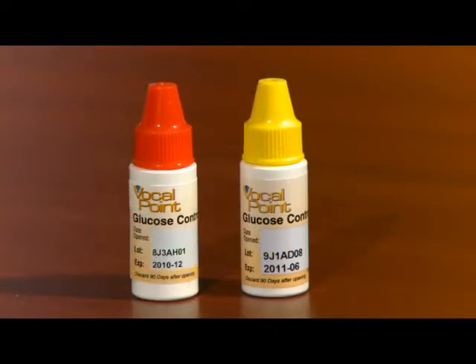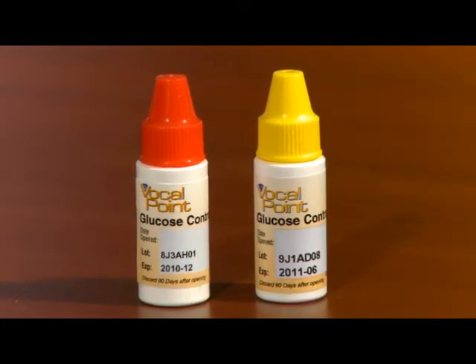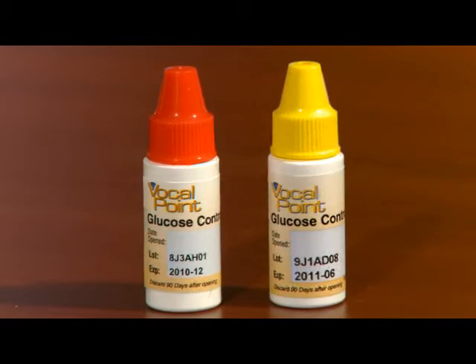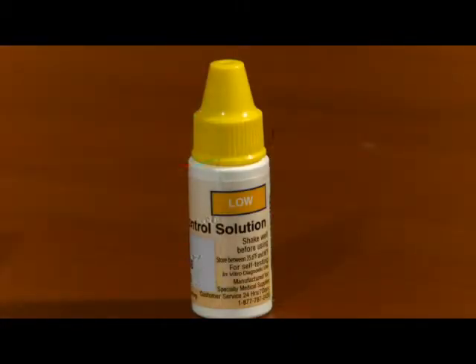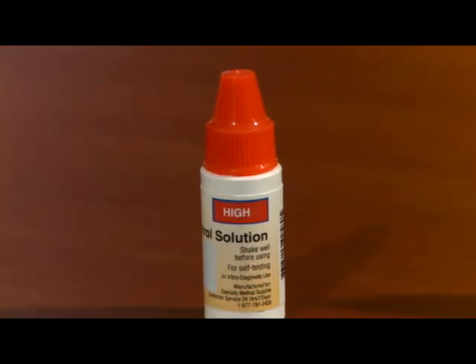Since there are two levels of control solutions available, the distributor may send you either control solution. It doesn't matter which control solution is used. Control solution is color-coded for easy reference. Our low control has a yellow cap and is labeled low. Our high control has a red cap and is labeled high.